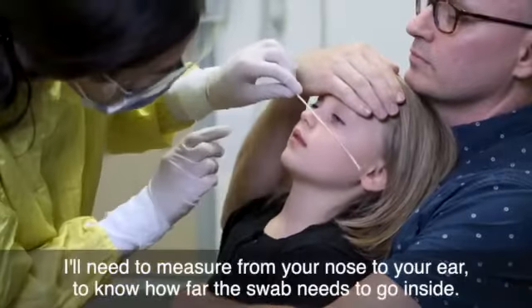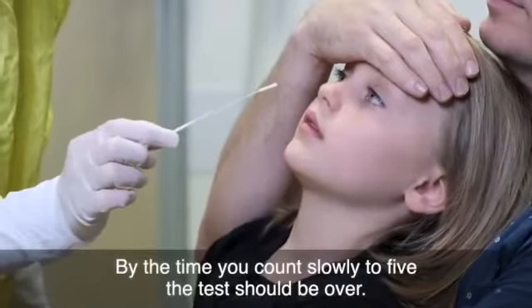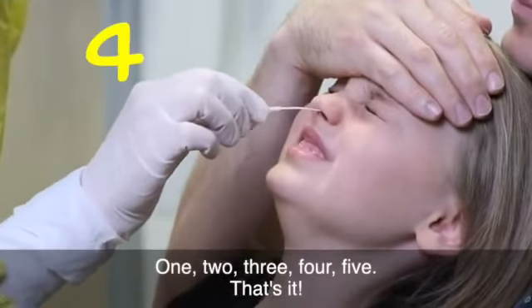I'll need to measure from your nose to your ear to know how far the swab needs to go inside. By the time you count slowly to five, the test should be over. One, two, three, four, five. That's it.